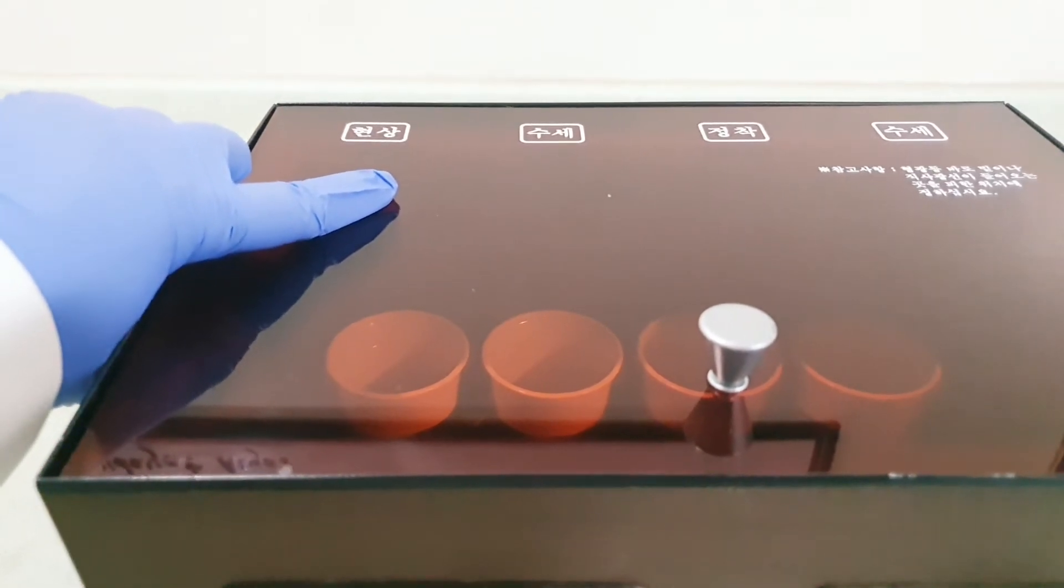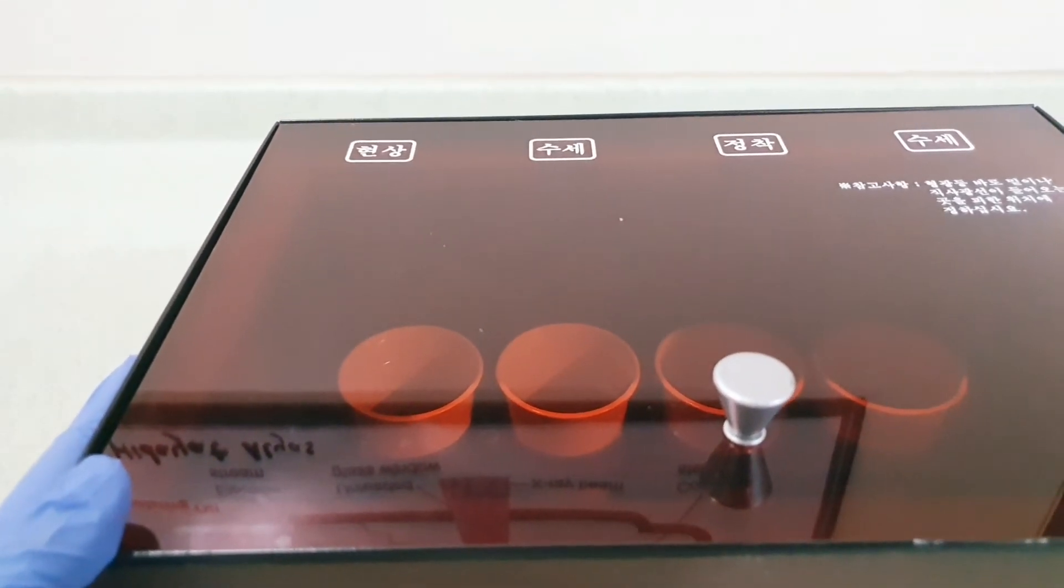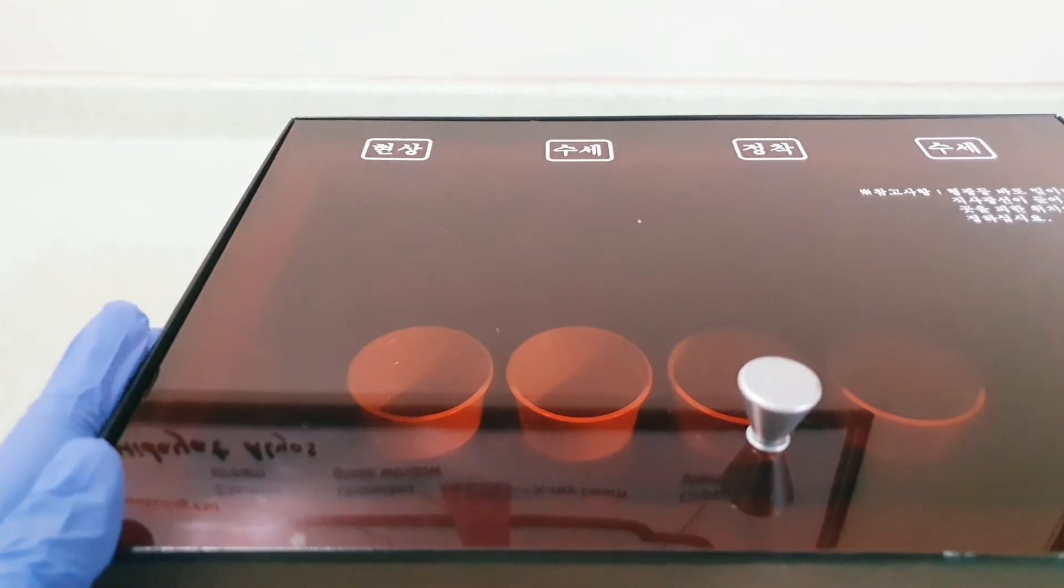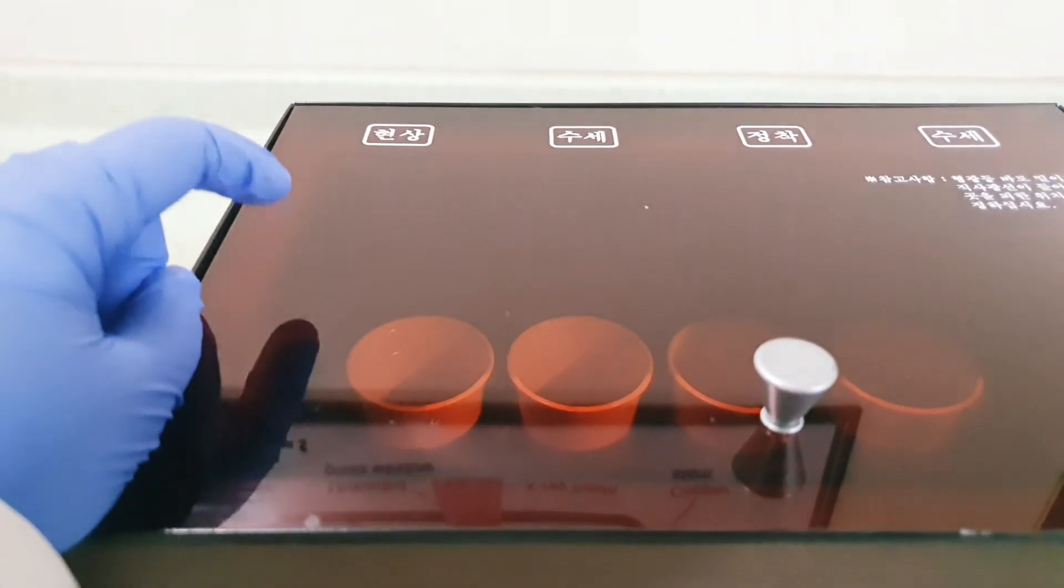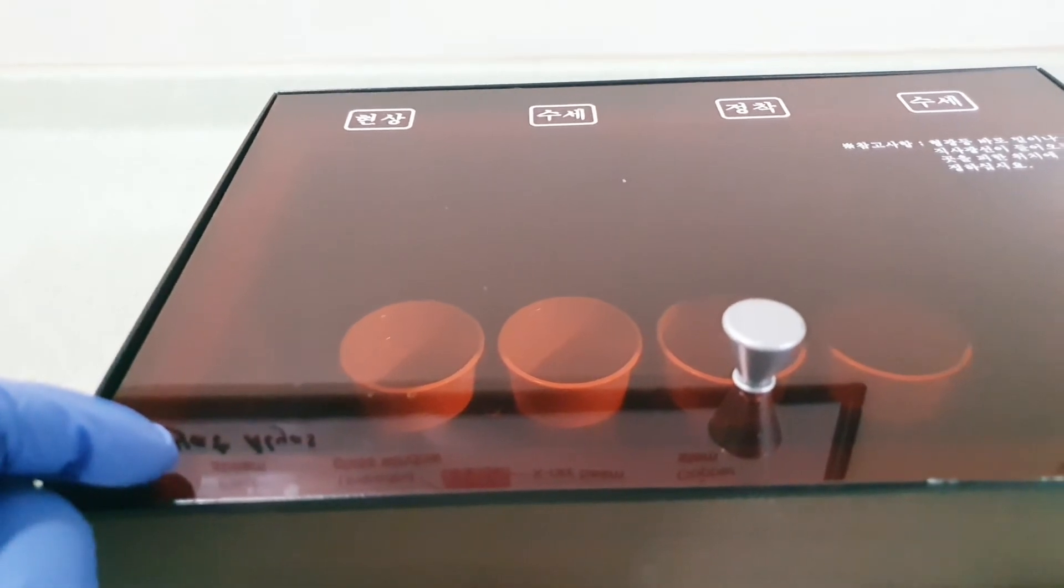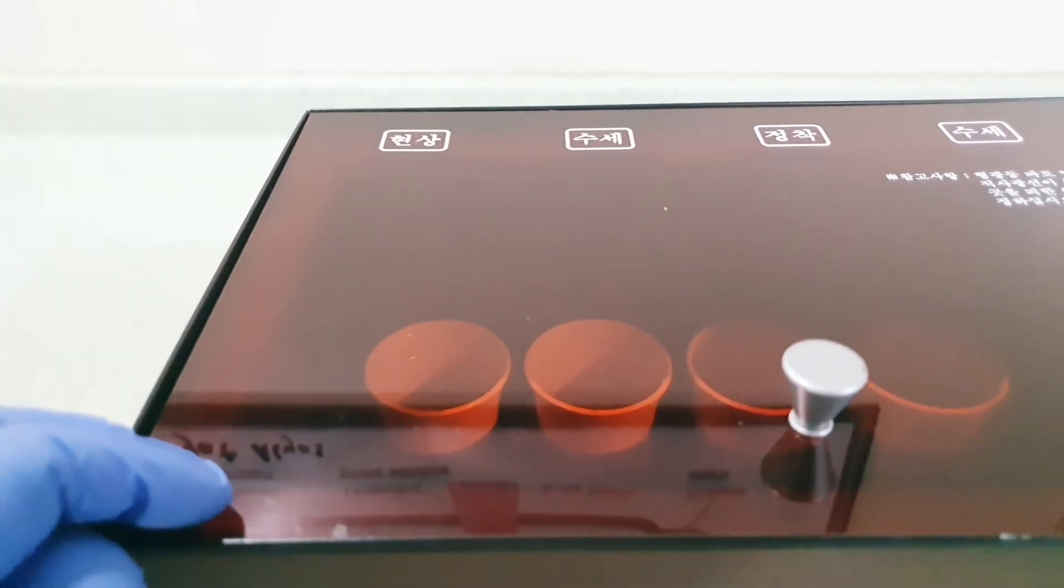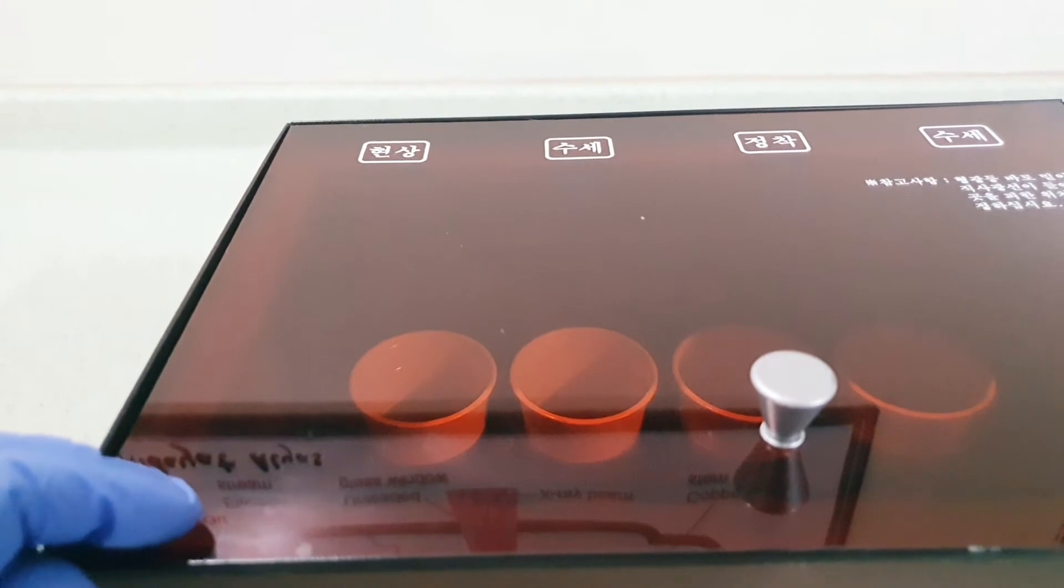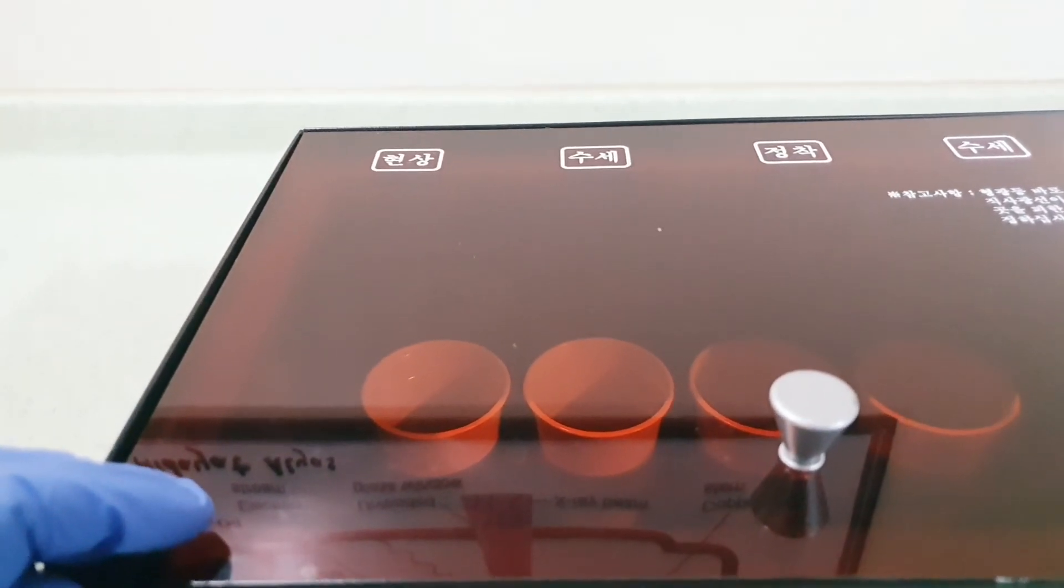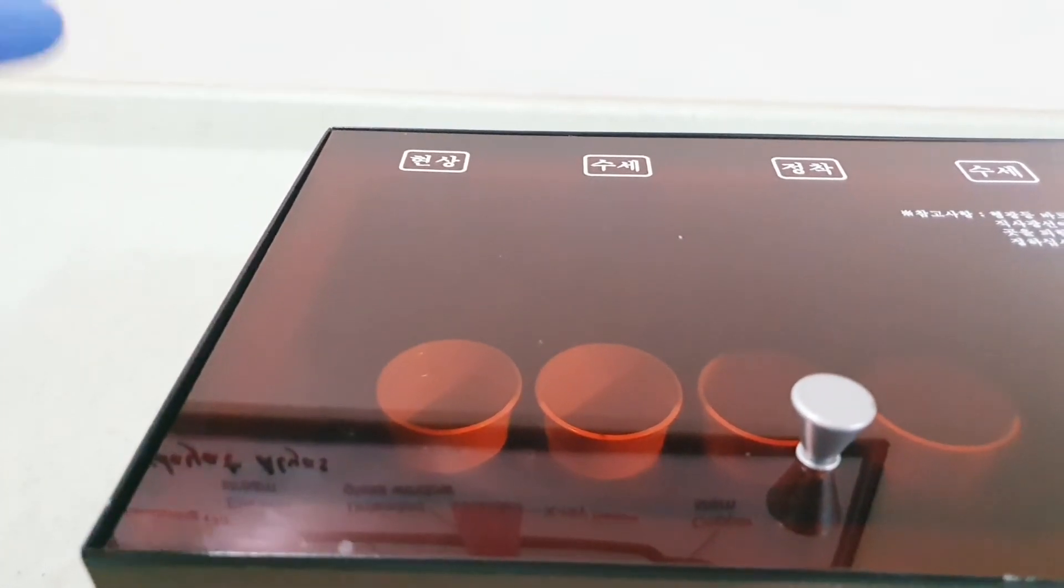Since the solutions are at room temperature, insert the film in the developer until you see dark gray to light gray areas. Once visible, keep it a bit longer using five-second intervals. Depending on the developer concentration and number of films processed, you may need longer duration. Stop when black areas are visible.